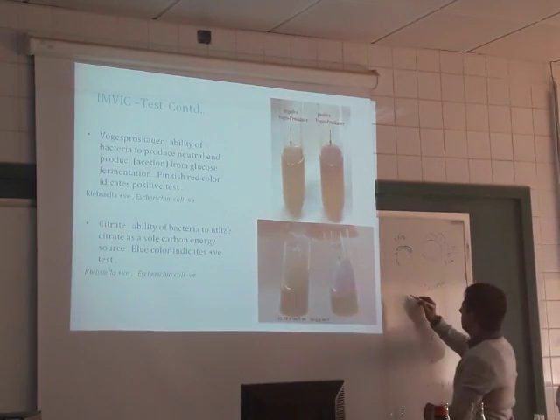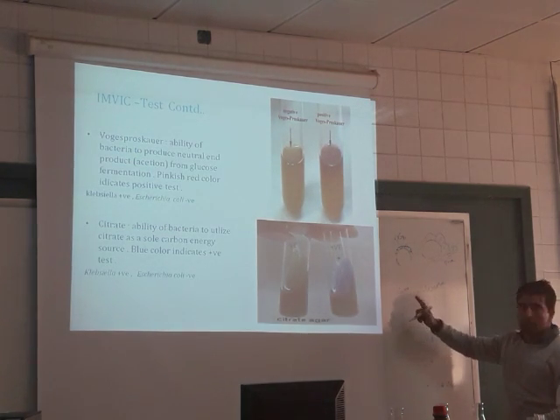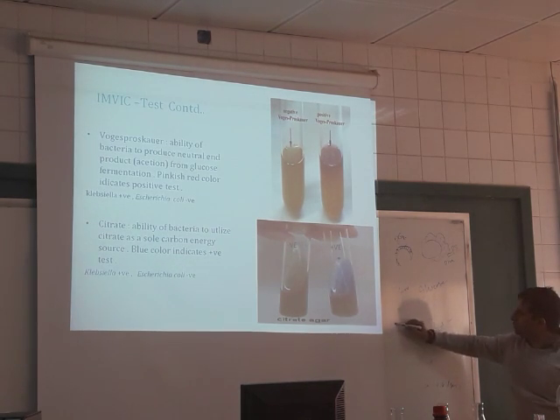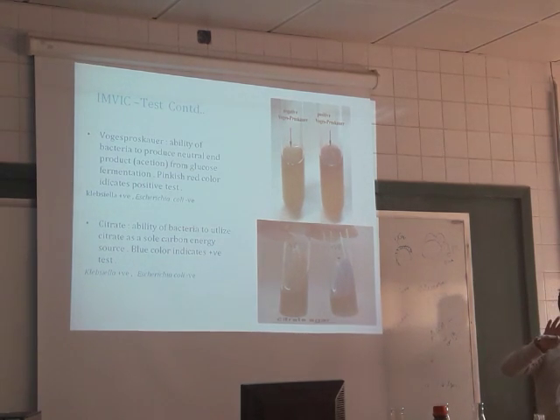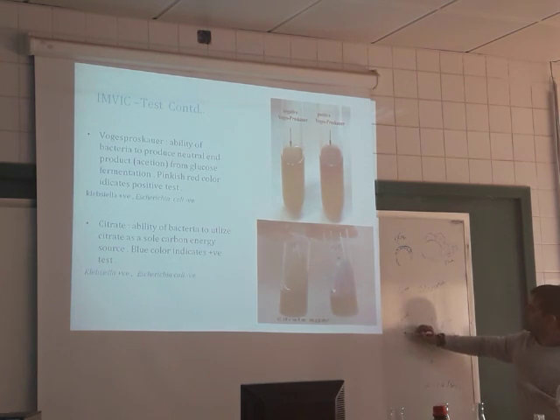What is this? Again, if bacteria produce acid, like lactic acid. If bacteria produce a neutral product, what is a neutral product? Neither acid nor base. If neither acid nor base is the end product, then the color is pinkish, but it's not clear here. It looks pinkish in color.